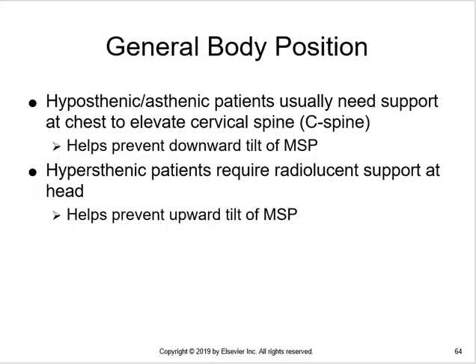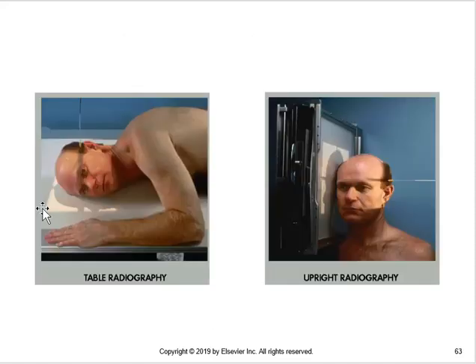So consider the patient's body habitus, and if you have a patient who you have to lay down and you can't position well, consider building up the patient and putting them into a position that may be a little bit better for their anatomy.